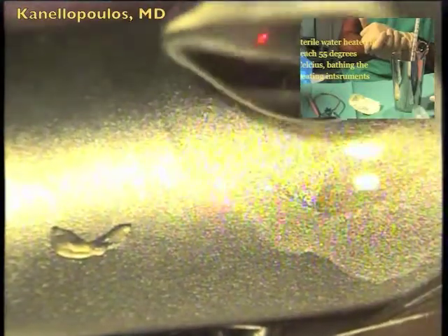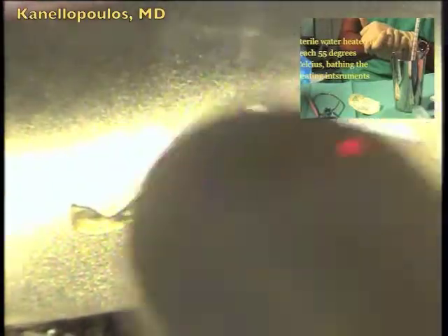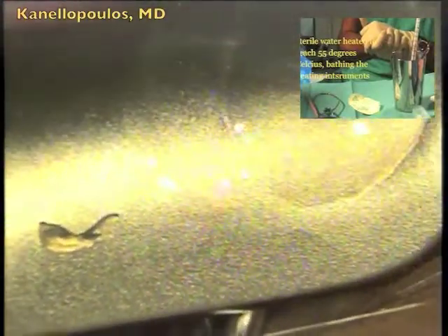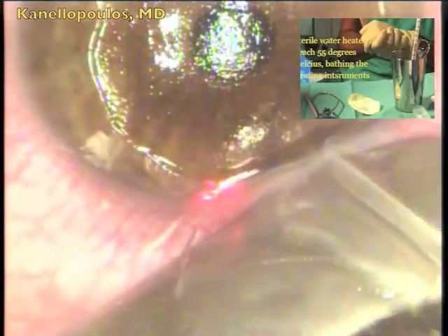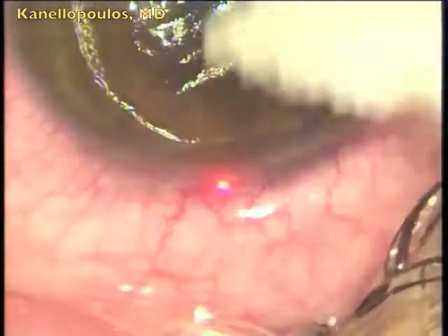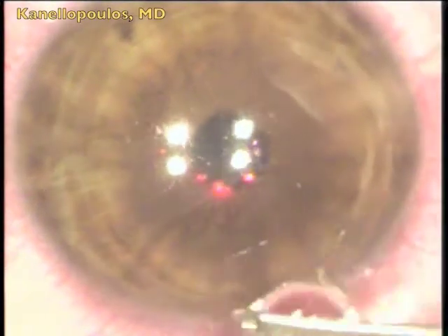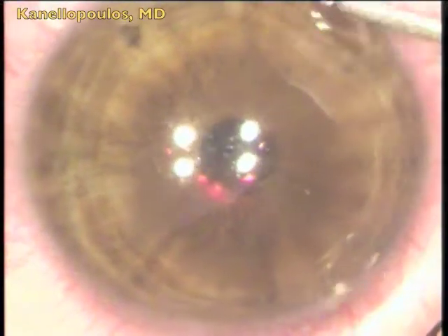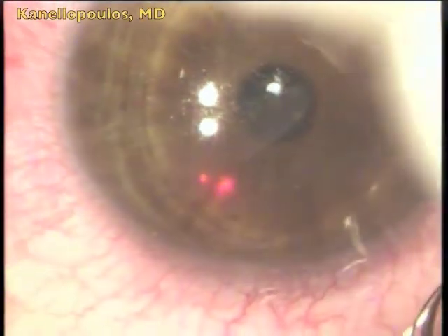I'm heating up the flap now — again, sterile water at 55 degrees Celsius. I'm trying to avoid having this water come in contact with the stroma, because this will cause significant edema and potential endothelial cell damage. This is sterile water, so it's very hypotonic — it swells the flap. I'm going to reposition the flap, then irrigate as I would normally, and of course suture the flap in place to try and take out the striae.